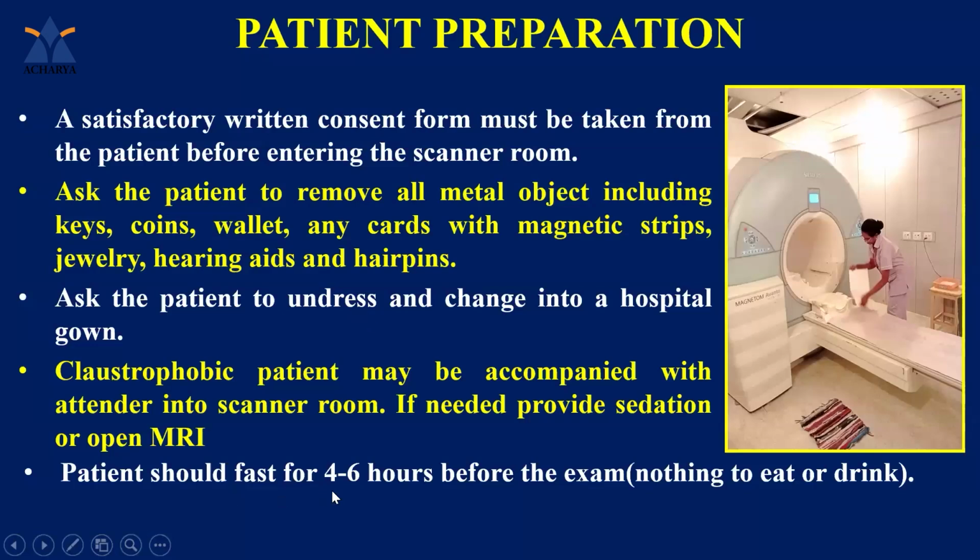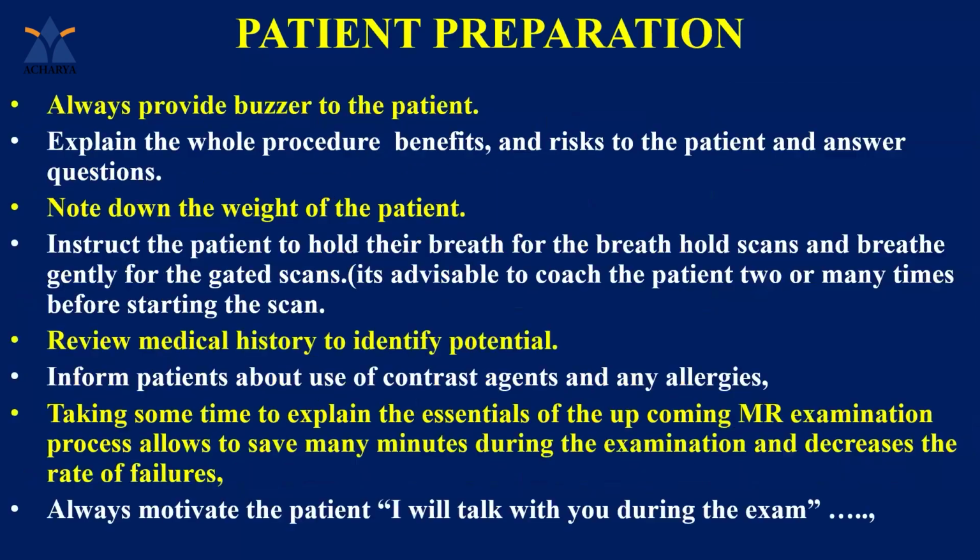The patient should fast 4 to 6 hours before the exam, so nothing to eat or drink. A satisfactory written consent form must be taken from the patient before entering the scanner room. Ask the patient to remove all metal objects, including keys, coins, wallets, any cards with magnetic strips, jewelry, hearing aids and hairpins. Ask the patient to undress and change into a hospital gown. A claustrophobic patient may be accompanied by one attender, or for an inpatient we can allow the staff nurse. If needed, provide sedation or recommend open MRI. Always provide a buzzer to the patients, very, very important.